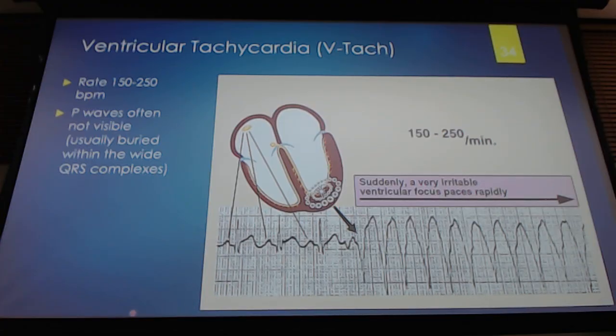For example, I'm not going to have you do any of this on the exam. I'm not going to ask you where the P wave is in this QRS complex. I just want to point out that in fact there is some P wave. If we look here, this is actually a P wave on the upstroke of this wide QRS. Okay, we have a P wave here. This one has a P wave all the way on top. So there are P waves that are buried, the atria still depolarizing.